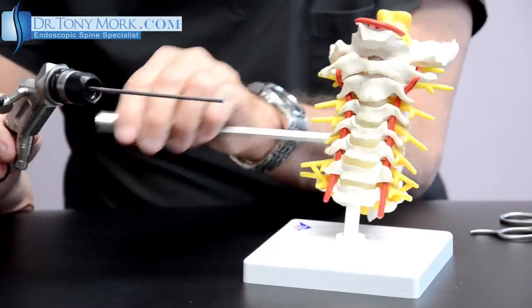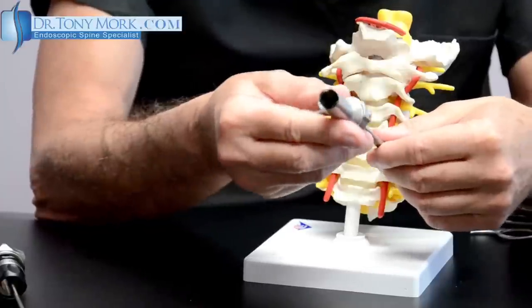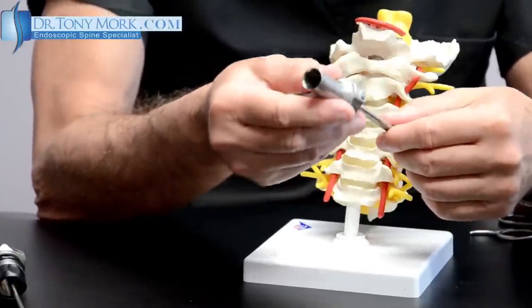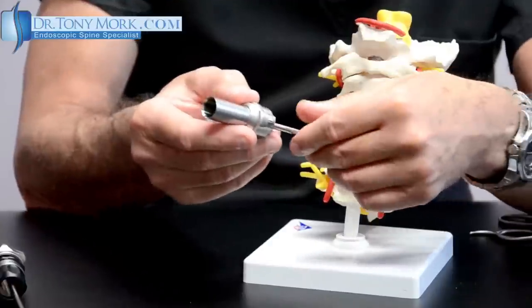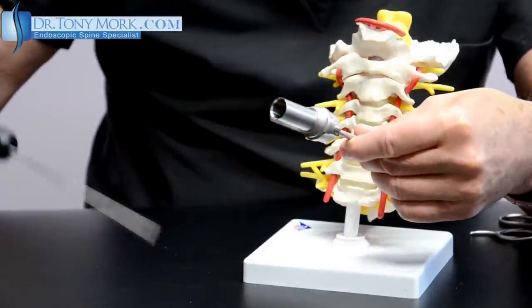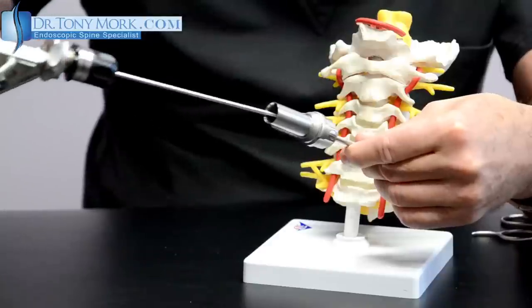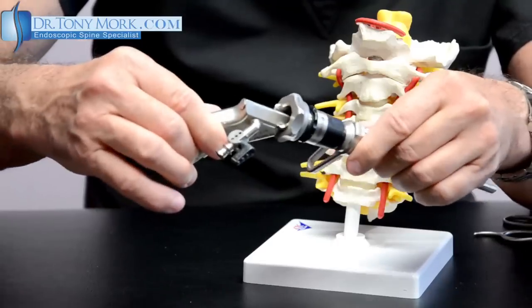Once we have this cannula — cannula meaning a hollow tube — it will allow the channel to the inside of the cervical disc. So it's going to be like that. At this point, the scope can actually be placed in here.